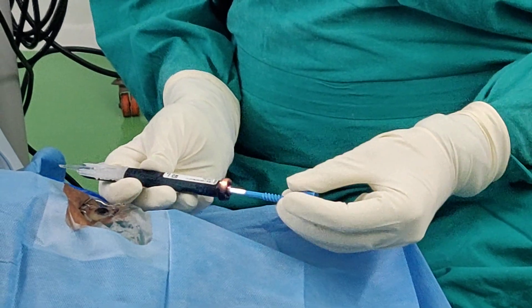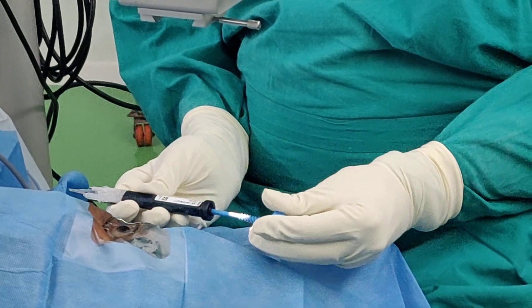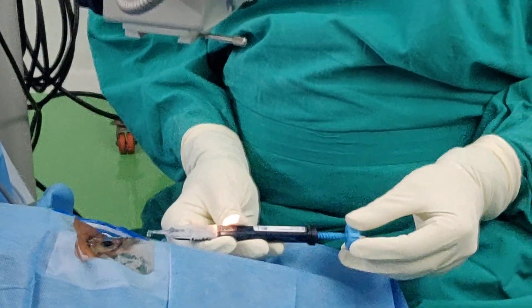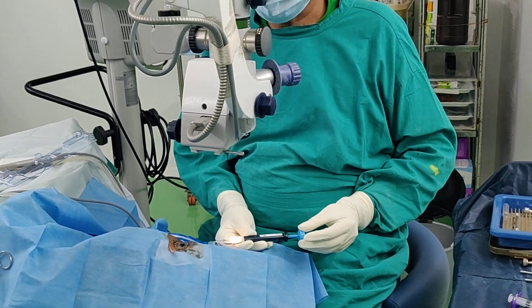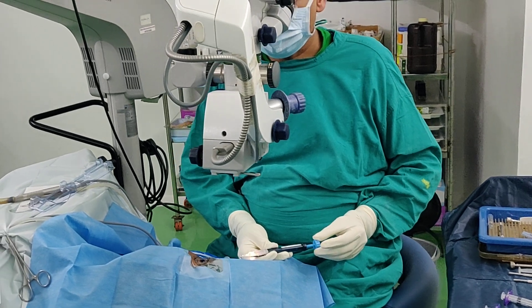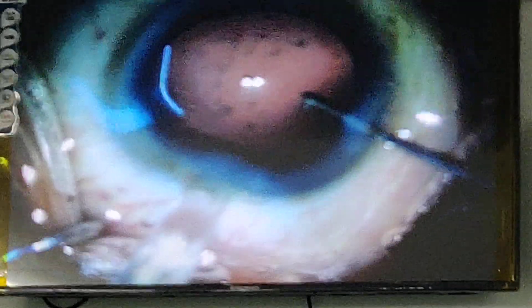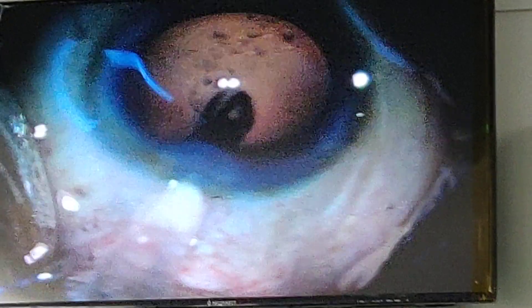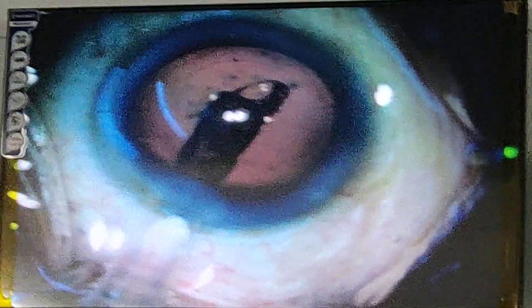Advance the plunger until you hear the click, then slowly advance the lens. Looking at the delivery system, it will be implanted. Insert the device into the incision chamber with the bevel down, and slowly advance the device and the plunger. Notice that the lens is coming out nicely.